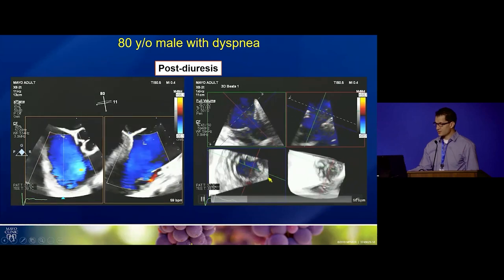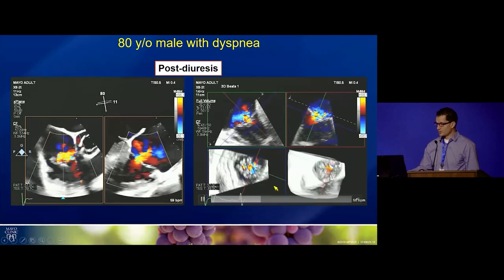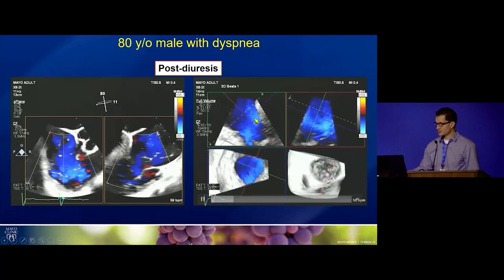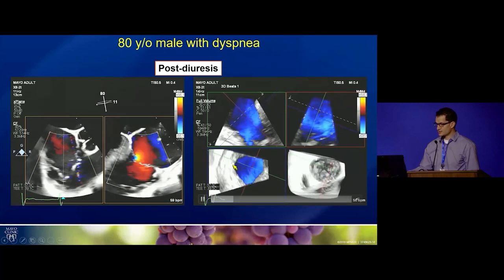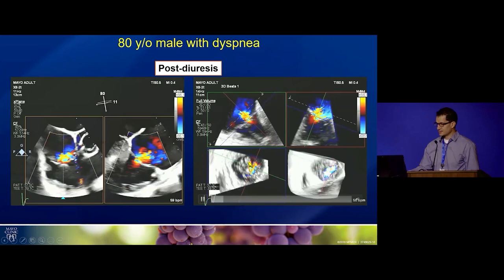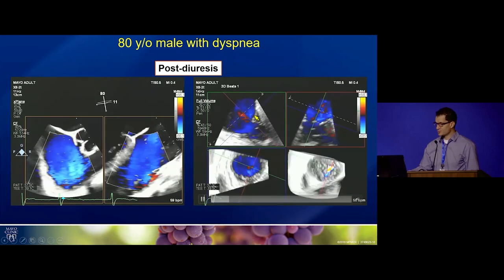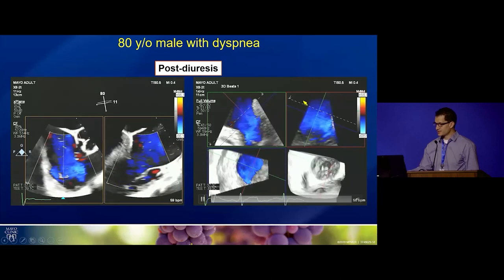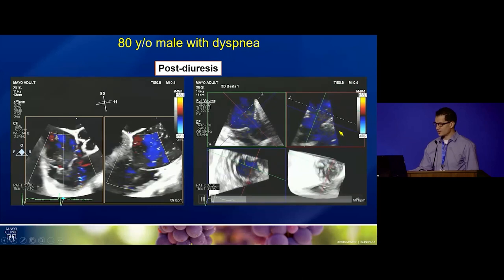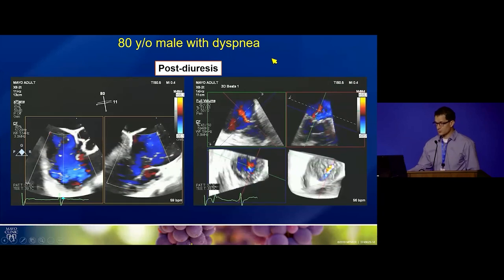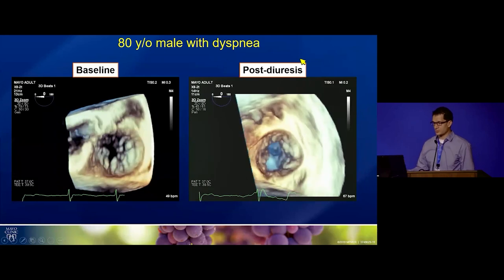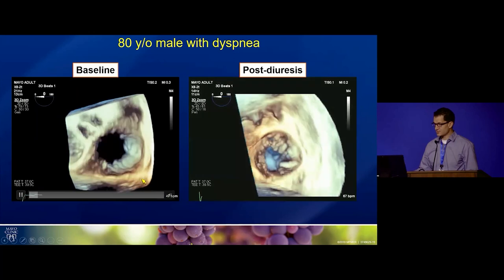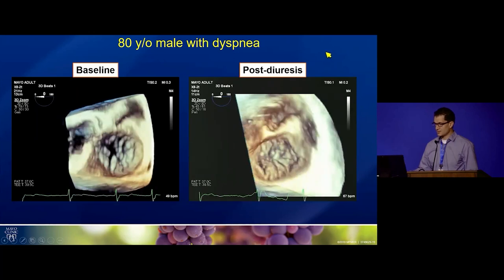Using 3D multiplanar reformatting, we can adjust planes to show what we want. The lower left panel shows a simulated short axis at the annular level, with the green line through the aortic valve providing an anterior reference for an anterior-to-posterior dimension. The orthogonal view shows the septal-to-lateral dimension. With 3D we can see these valves in a way that's really not possible with 2D. Baseline versus post-diuresis showed a dramatic difference.